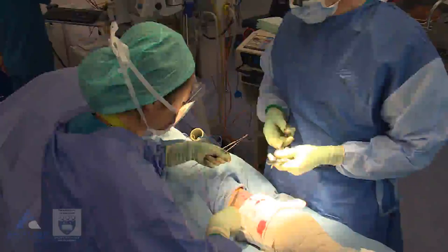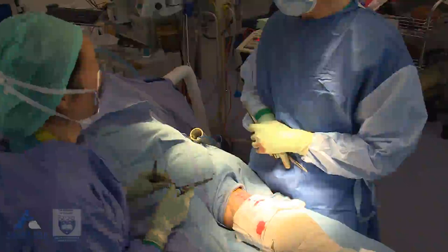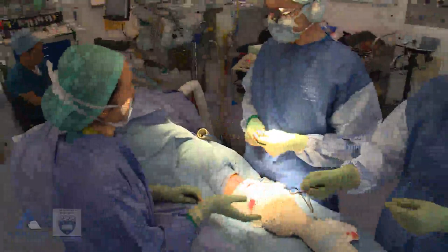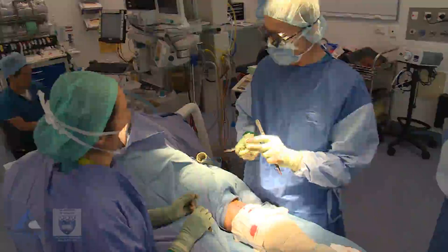Are you aware of any particular types of wound where that sort of suture might be most relevant? Wounds where you think there's going to be a bit of tension? Yes, possibly because you've got two threads, but also very thick skin and subcutaneous tissue. The scalp is one of those areas where you might consider that — the deep bite can go all the way through the thick subcutaneous tissue, and you can also put a superficial bite which can approximate quite closely. Both of those are good reasons, and I think you can do that now. Thank you.